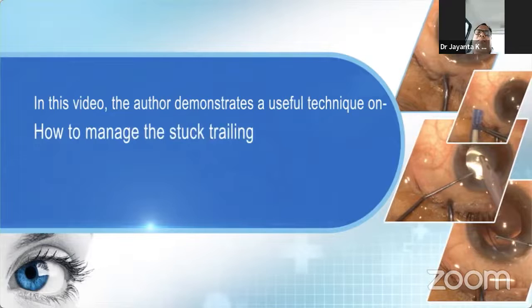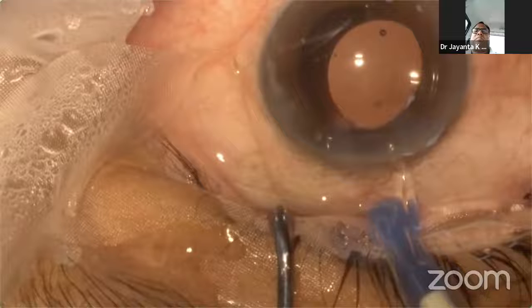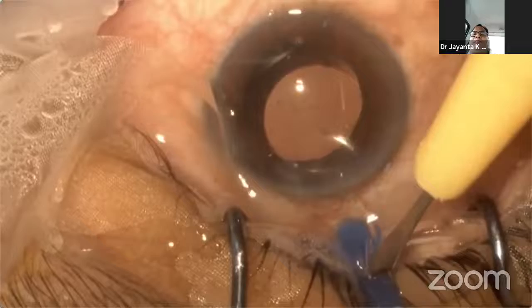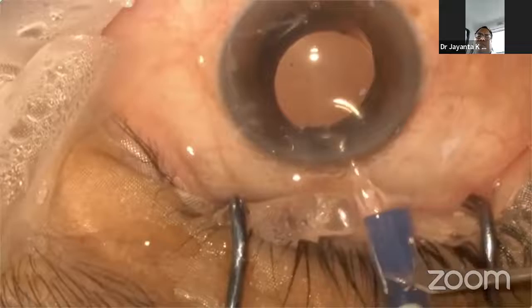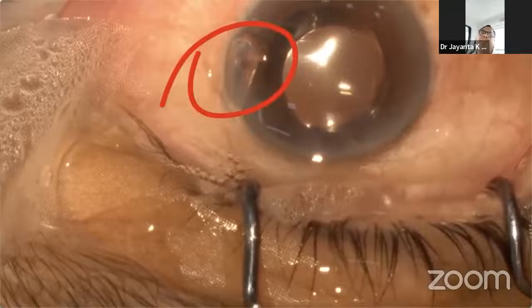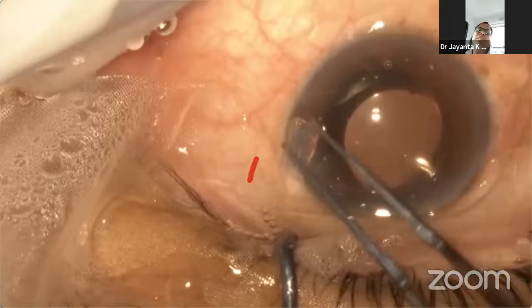In this video, the author demonstrates a useful technique to manage the stuck trailing haptic of the IOL which was trapped in the cartridge during implantation. The moment the trailing haptic was found stuck in the plunger, I hold the plunger in my left hand and, using my dominant right hand, I cut a U-shaped fashion block in the silicone plunger with the help of a 15-degree knife which was used for making side ports. By the moment the cut portion of the silicone plunger is separated from the rest of the plunger, the trailing haptic gets released automatically without any further manipulation.